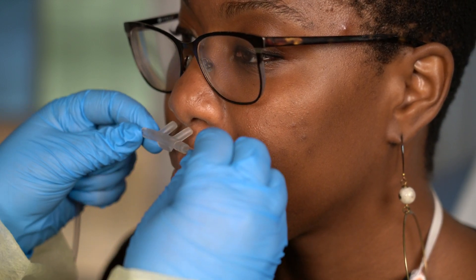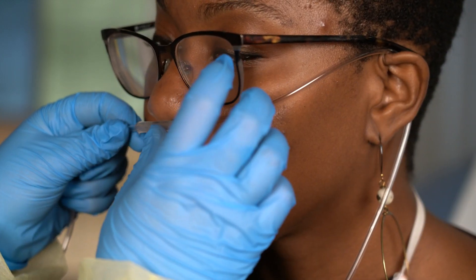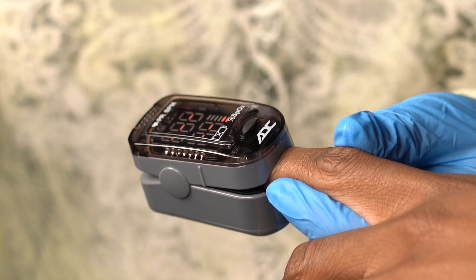Oxygen should not be started in close proximity to flames or fire. The nasal cannula prongs should be facing down as you place them. For optimal results, make sure the person's nose is not blocked. The tubing will go over the patient's ears to keep it in place. After the oxygen has been flowing for 15 minutes, check the patient's oxygen levels again using the pulse oximeter. Please note that with children, sometimes taping the tubing to the face with medical tape can help to secure the nasal cannula.